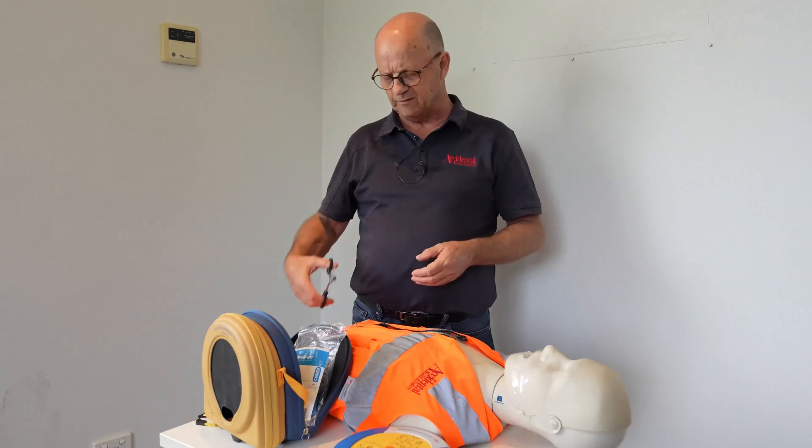On some occasions the defibrillator might say 'no shock required', which means it does not sense any activity in the heart that it can correct, so no shock will be given. When it says no shock required, please continue with your CPR — it's very important to oxygenate the brain. In the meantime, emergency services will arrive and may be able to restart the heart.